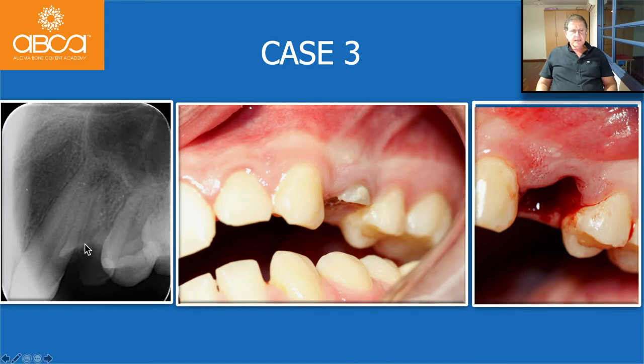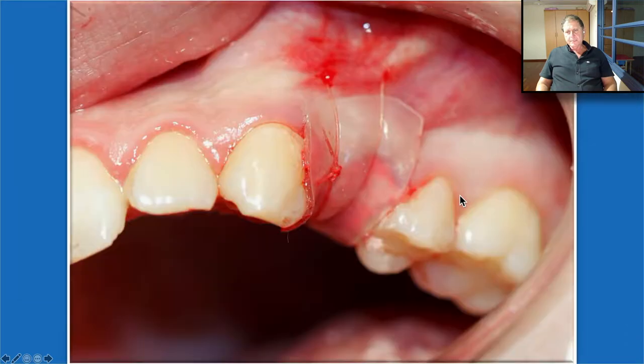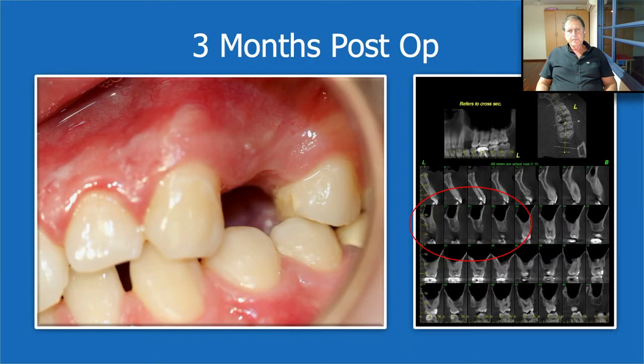Another case: we needed to extract these teeth. You can see the papilla here — same protocol. We inject the Bond Apatite, press strongly first with the gauze and finger, then with the periosteal elevator, slightly overfill, then take the Oraid, trim it to the size we want, it sticks to the mucosa, and then we secure it by suture exactly according to the protocol. Of course, we tell the patient to avoid playing with it and not to rinse with salt water. Three months post-op, the papilla is perfectly in place, bone perfectly formed because it was very well protected, and the soft tissue appearance is wonderful.